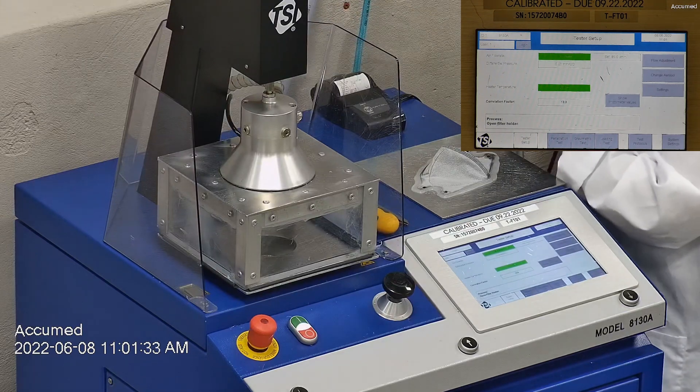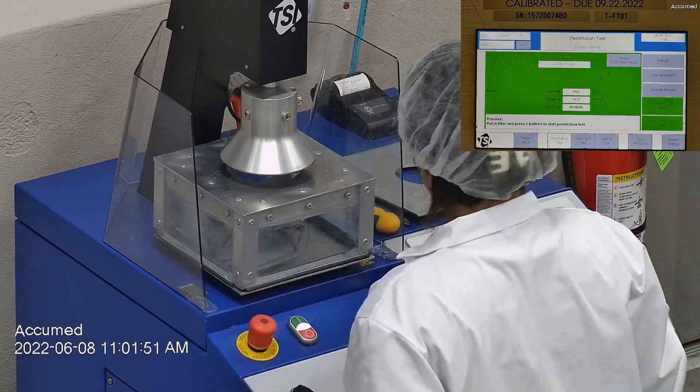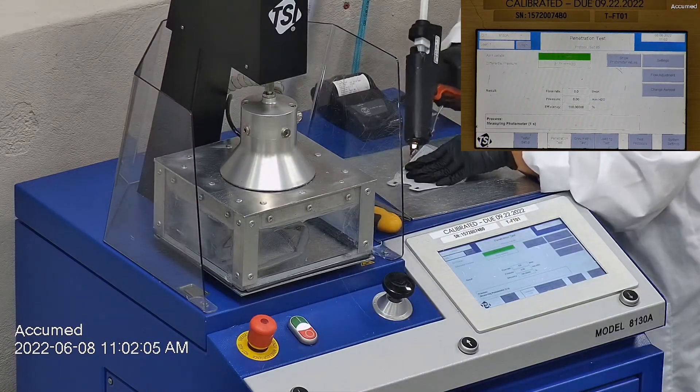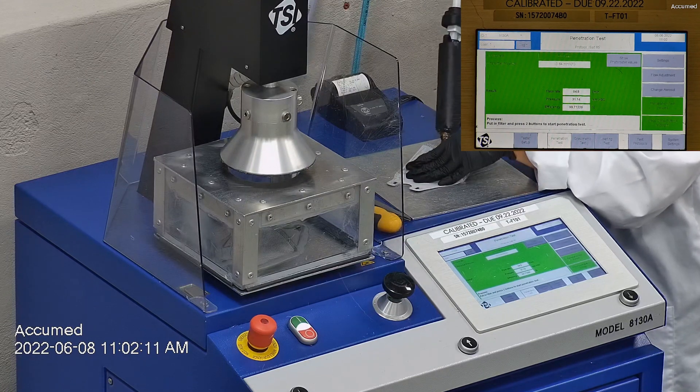F stands for airflow rate, which we test at 85 liters per minute. R is for resistance, also referred to as pressure drop — this correlates with breathability, so the lower the number the more comfortable and breathable the mask is. E stands for filtration efficiency percentage.